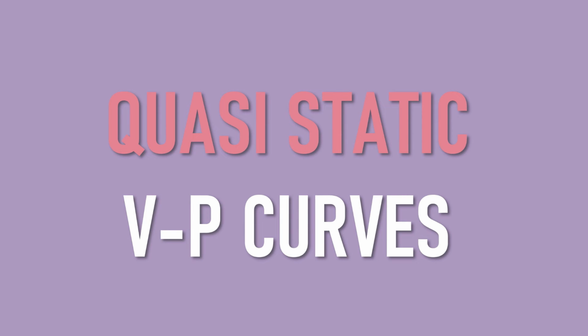All the curves that I've shown you so far are dynamic curves that can be used to assess dynamic compliance. However, the textbook approach to pressure-volume relationships is to devise a static volume pressure curve in an anesthetized paralyzed patient. The lung is gradually inflated and pressures are measured during incremental volume increases. It is called quasi-static because, of course, air must be continuously absorbed from the alveoli, and the volume applied is not necessarily the static lung volume.